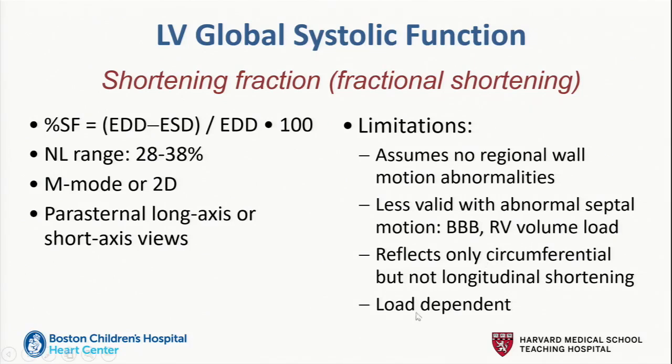It also reflects only circumferential, but not longitudinal shortening. You're looking at it as it goes from a big circle to a little circle, but you're not looking at that other component, that base to apex contraction of the ventricle. And then finally, it's load dependent.